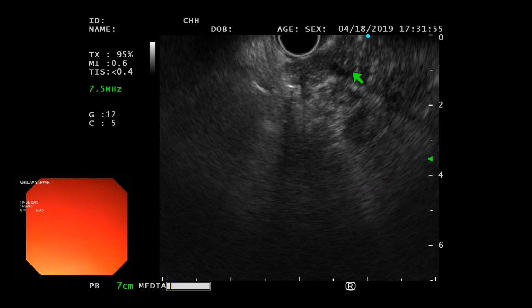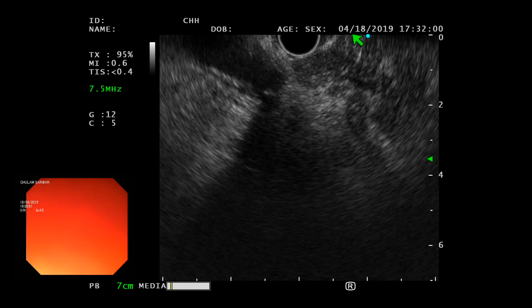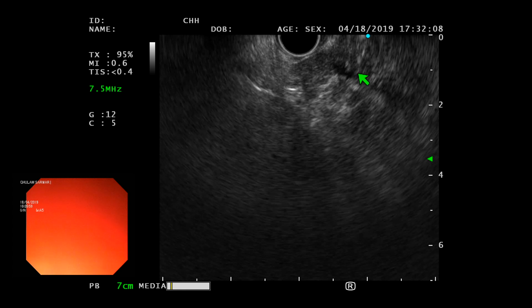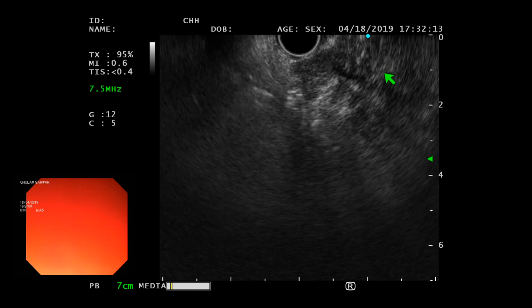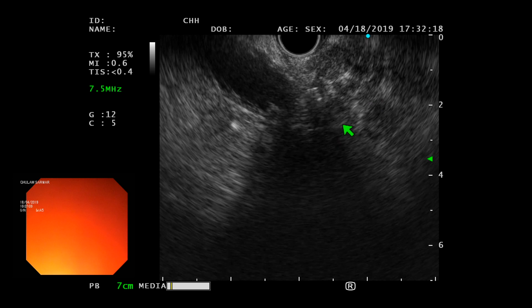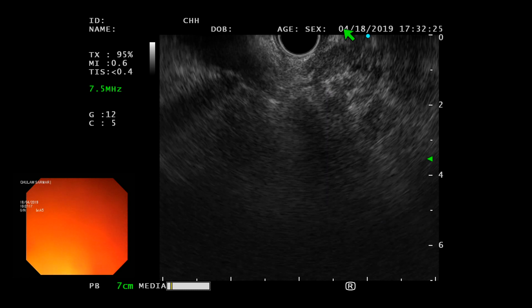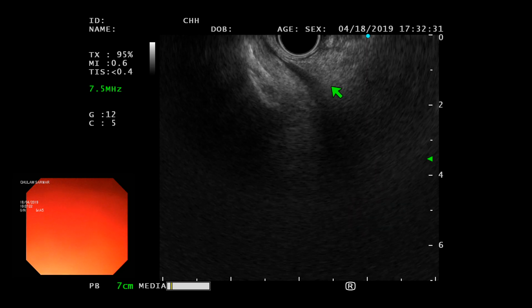So that's what you would see, the pancreatic duct would cross the bile duct and open up there. But you many times see that better from the D1, because you really don't appreciate any major portion of the ventral pancreatic duct. Right close to the neck of the pancreas, when you see that from D1, the pancreatic duct would be coming here, going up. It will take a little turn and then turn upwards, while the bile duct would be here coming down right here, and there won't be any ventral pancreatic duct.